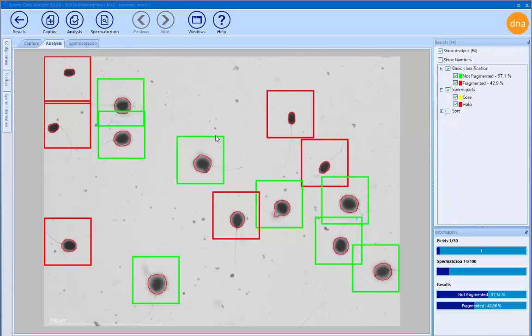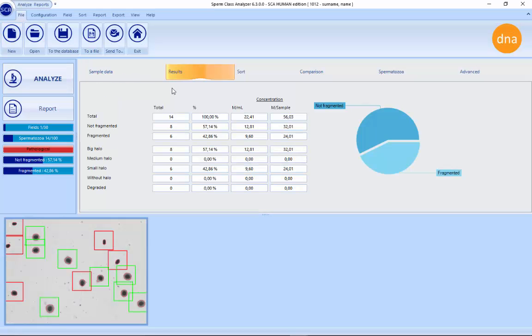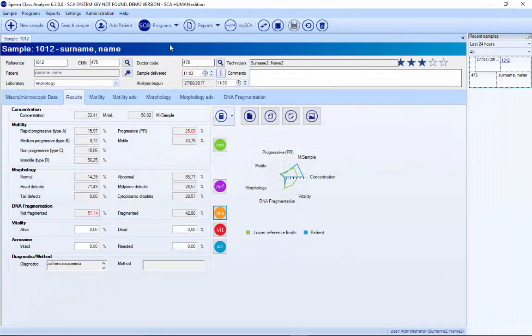The system gives the DNA fragmentation percentage, and when you exit it puts the results in the database. For vitality, it's also possible to do this automatically.